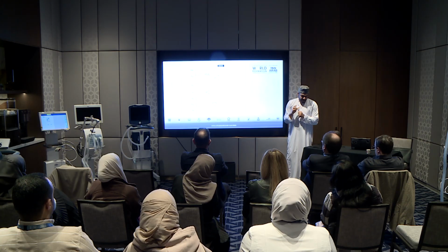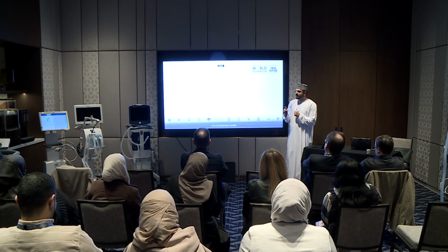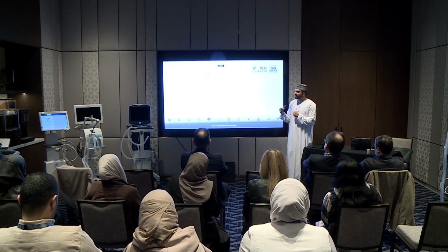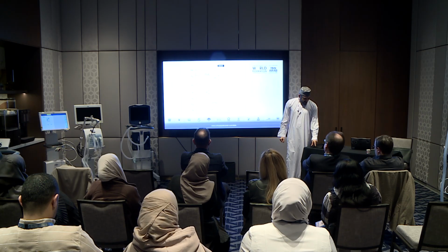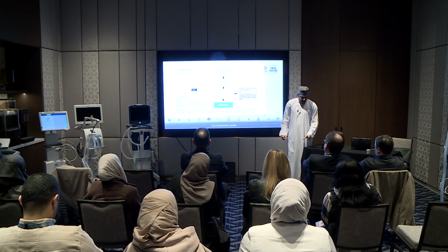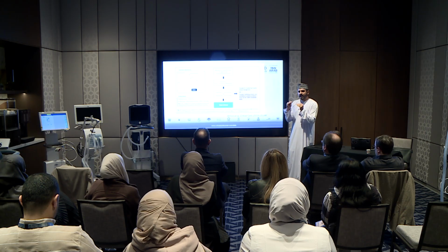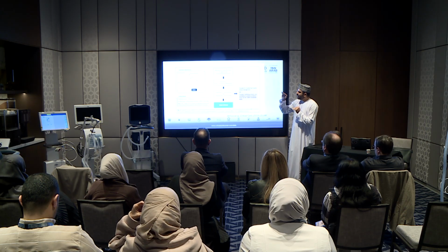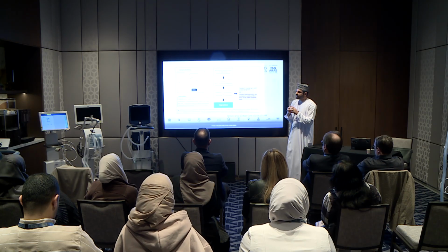And because you want to calculate the Pmus and the change in the pleural pressure, and not everyone has an esophageal balloon, a study was done that looked at the correlation between the Pocc and the other measurements and gave an algorithm about how to use it in clinical settings.